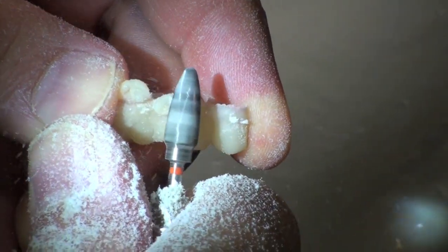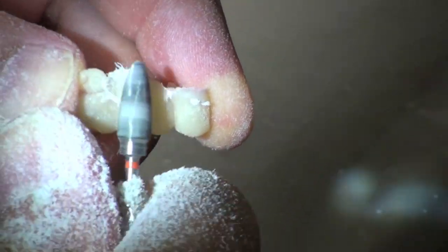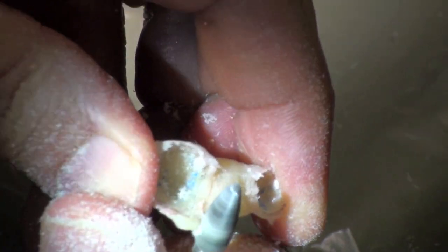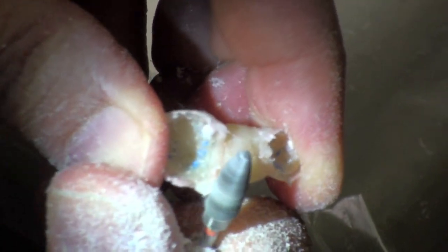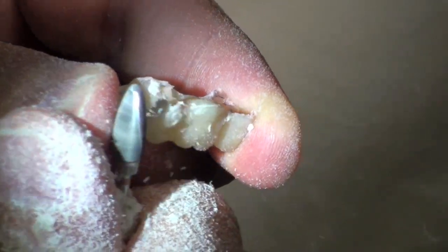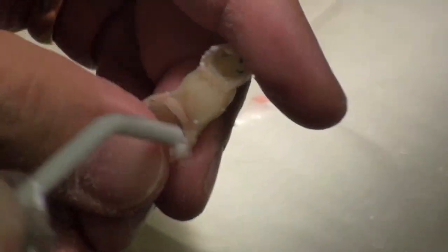Bulky here, obviously. Let's take that bulk off. Bulky here obviously, but you don't know where until you look underneath. See where that margin is. Let's put some air on here and try this on the model and see where we're at.